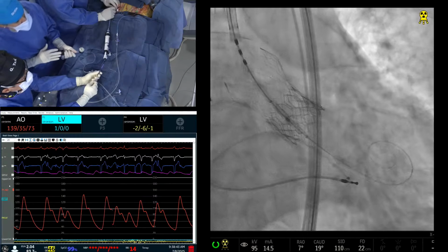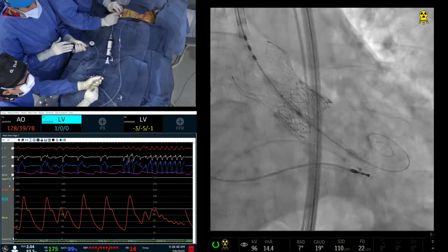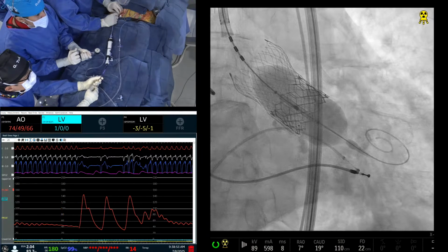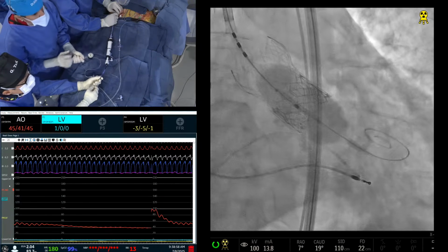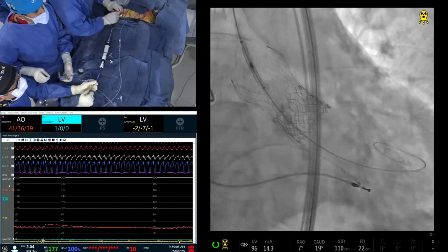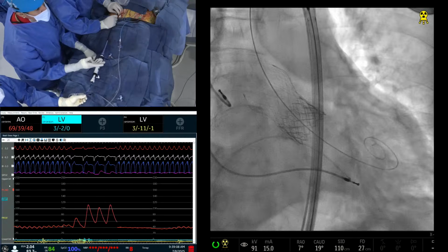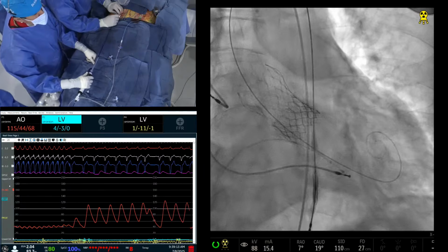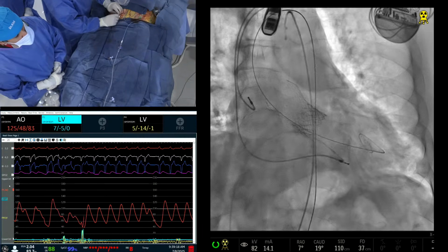180. Lungs down. Go. Okay, going up. Okay, now get the pigtail ready. Although it doesn't matter, there was no gradient to begin with. Okay, keep pacing. Back up. Pacing off. We still want to do hemodynamics. We want to show that we did not create a gradient. Give me a pigtail next. LV. Stan, you can check now.